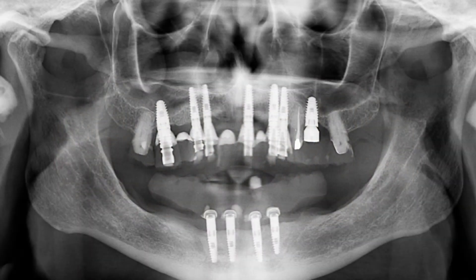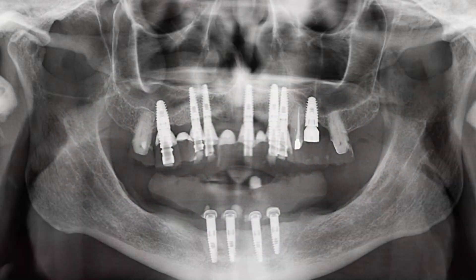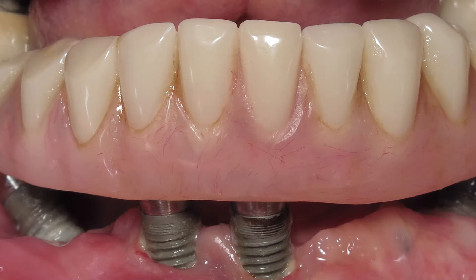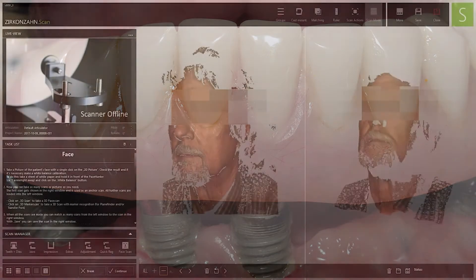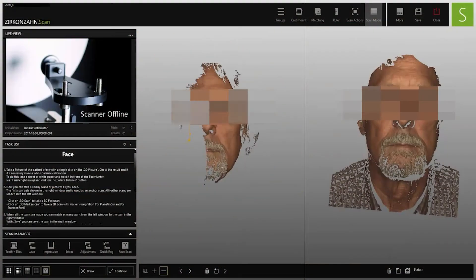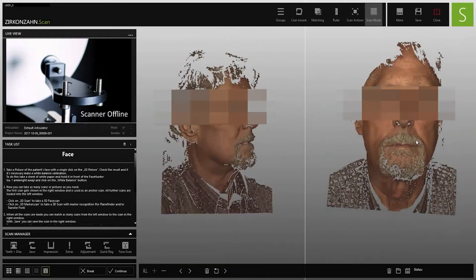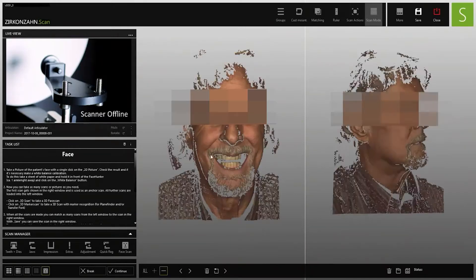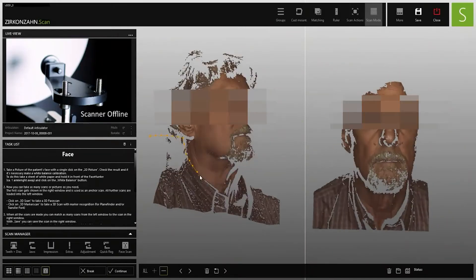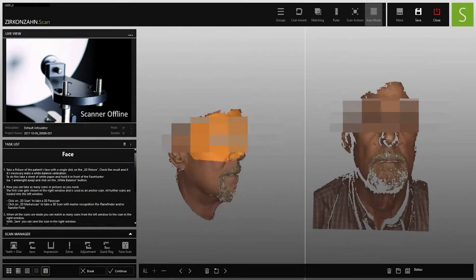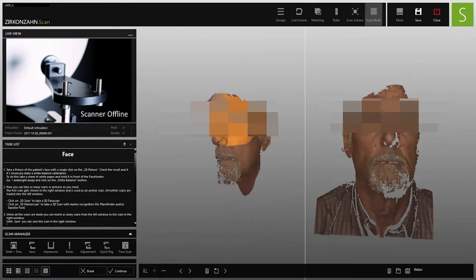The patient came to the dental practice with a mandibular atrophy, which requires the replacement of the existing implants. To carry out the treatment, the digital workflow was used. The patient's data was recorded with the Plane system and the Face Hunter and transferred into the software without losing important information.